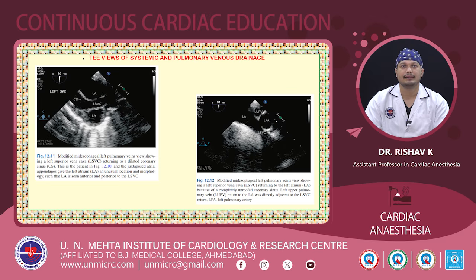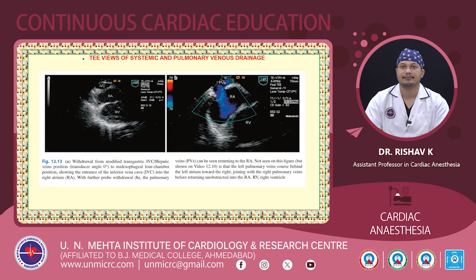Also, another midesophageal left pulmonary vein view here that we are seeing is the presence of an LSVC, and as a result of the LSVC the coronary sinus is dilated. And the next image to the right is showing a modified midesophageal left pulmonary vein view, whereby the LSVC is returning to the left atrium directly because of the presence of an unroofed coronary sinus.